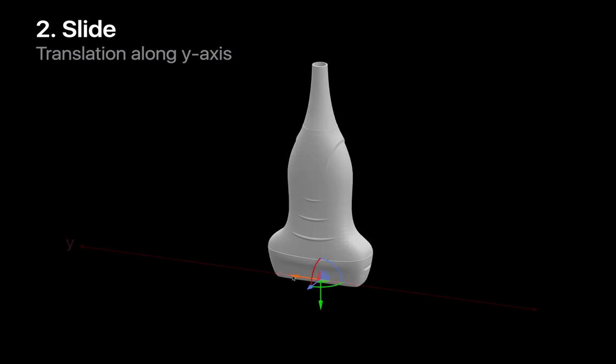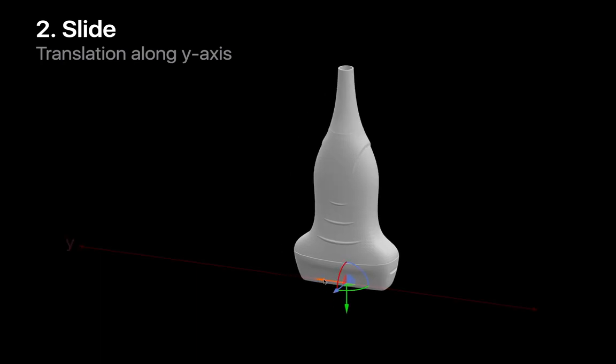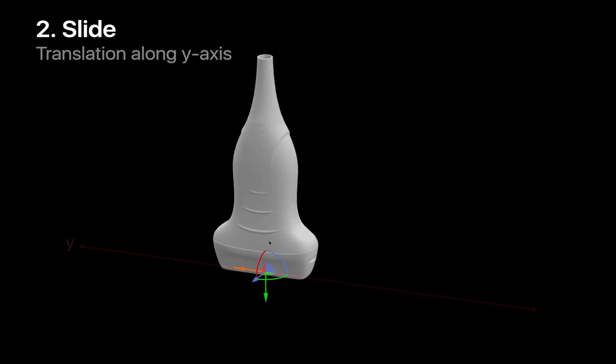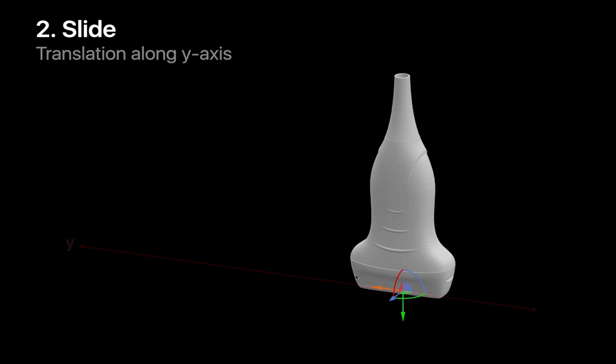Motion along the long axis of the probe across the body is called sliding. Notice that the angle of the probe relative to the skin surface remains perpendicular and fixed.